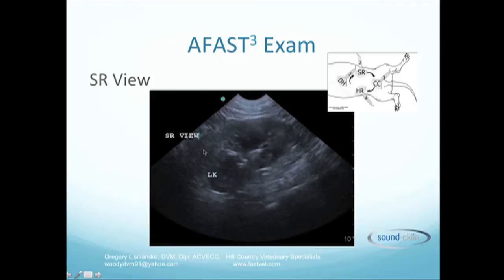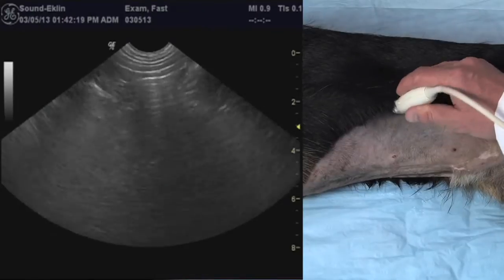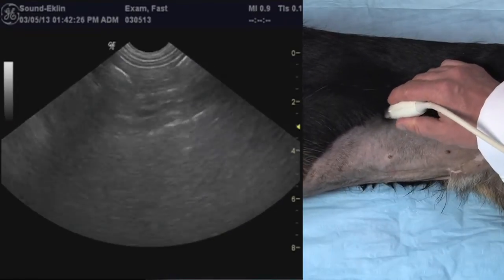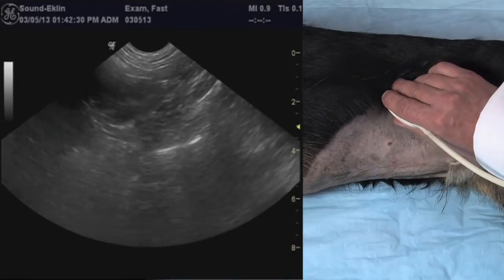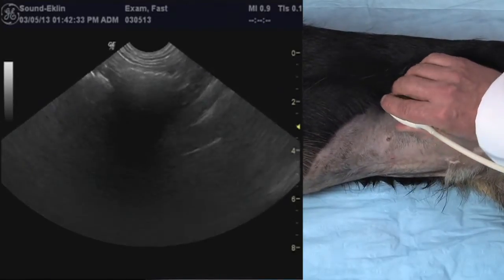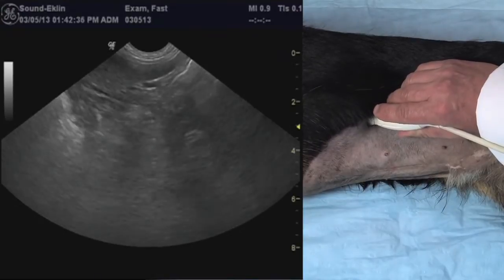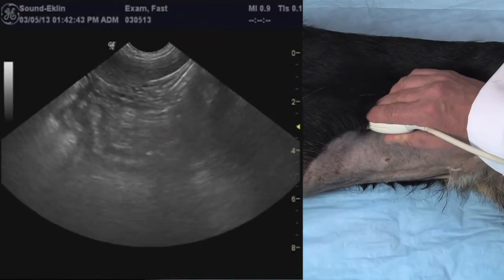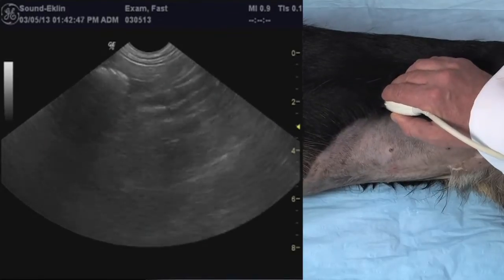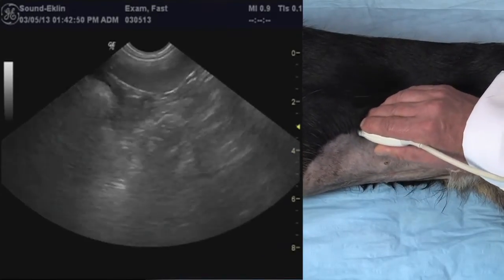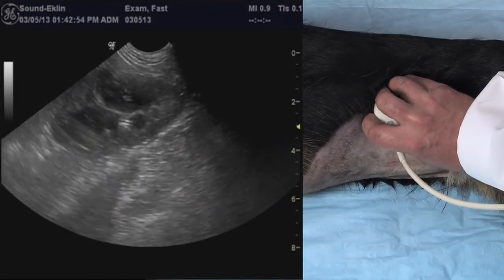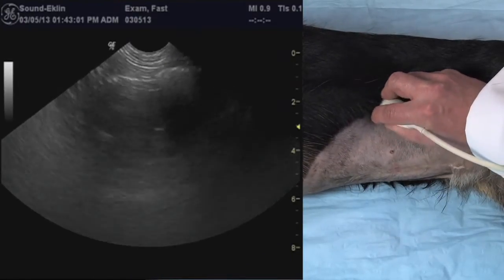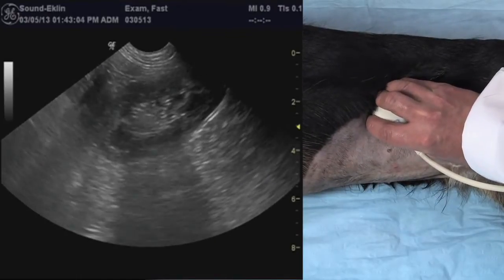Moving on, we move to the SR view that's just caudal to the ribs to pick up the target organs, which are the left kidney and the spleen. In this view, once we achieve seeing the left kidney, we know that we have a window into the retroperitoneal space. By picking up the spleen in the foreground, we know we are in the intra-abdominal space. The left kidney is in view and we can pan ventrally towards the tabletop, cranially and caudally, spotlighting this area for free fluid.